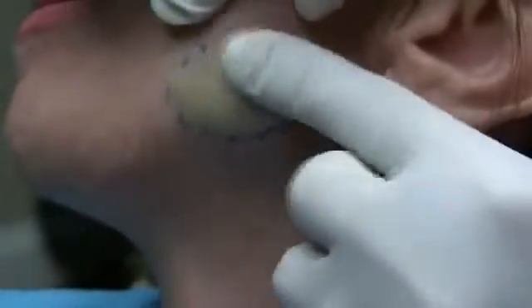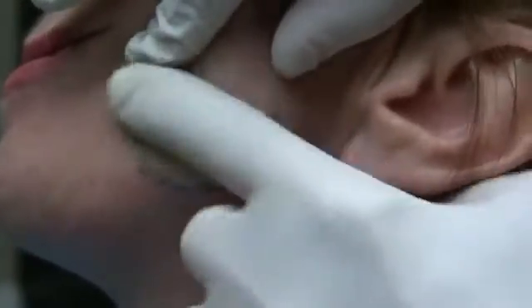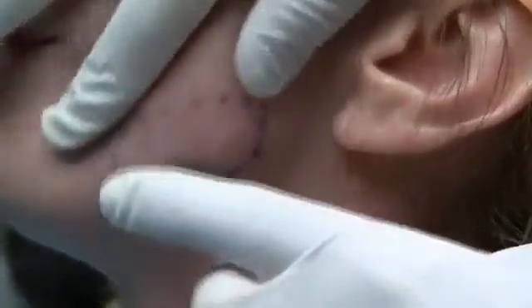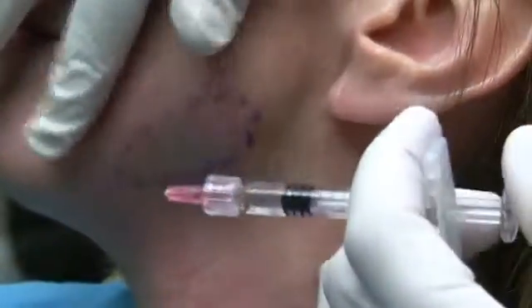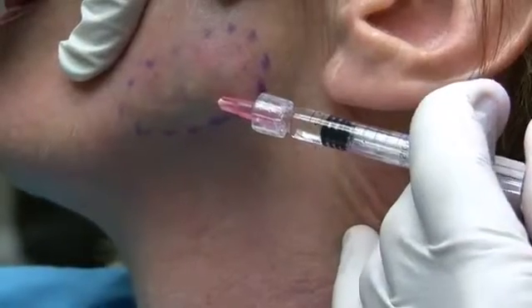I've made the statements many times that on some patients fillers go further than others, and I'm not sure if that has to do with the thickness of the dermis versus the epidermis, the amount of subcutaneous fat, but on this patient it's actually going pretty far. We've used just over half a syringe, and I've got definitely a noticeable result here. So we will continue on this line, and we have 2 syringes budgeted for this area, so we'll be able to do a lot with it.